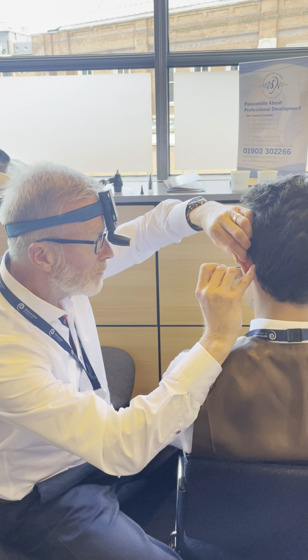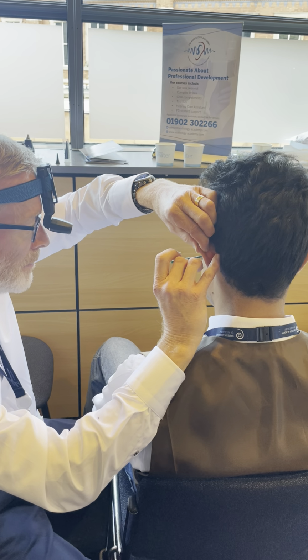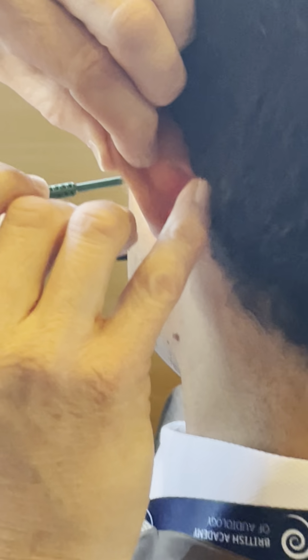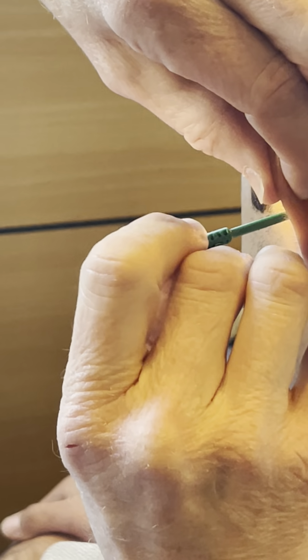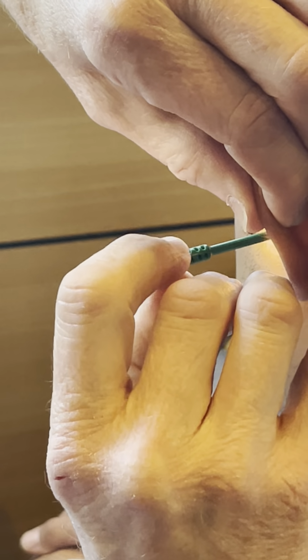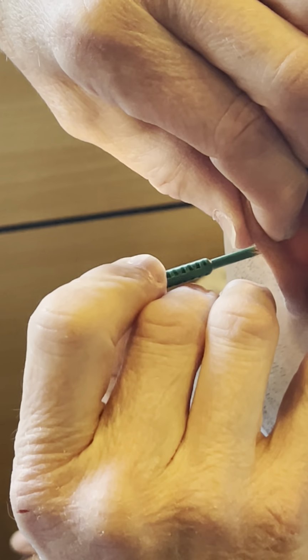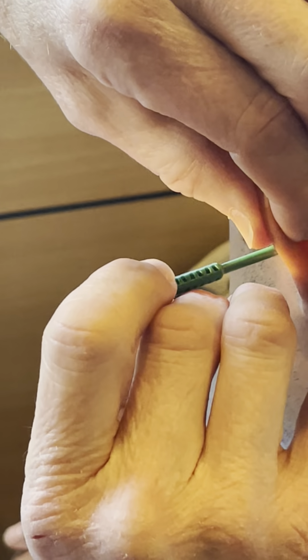You okay still? Yeah. And you may find we're starting to go deeper, so you may start to feel just slight discomfort as we're putting a little bit of pressure on the ear canal. I'm feeling a little bit of resistance trying to go any further. Is there any discomfort there? No. Good. It's fine.